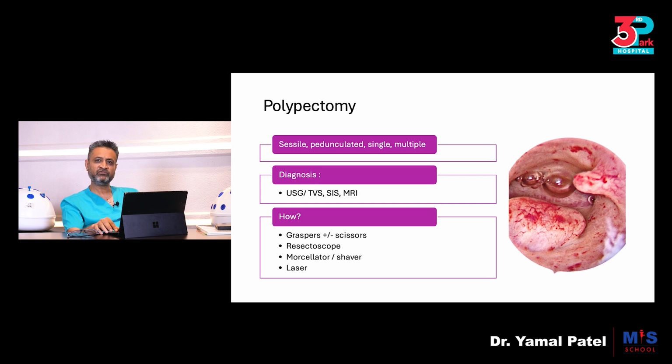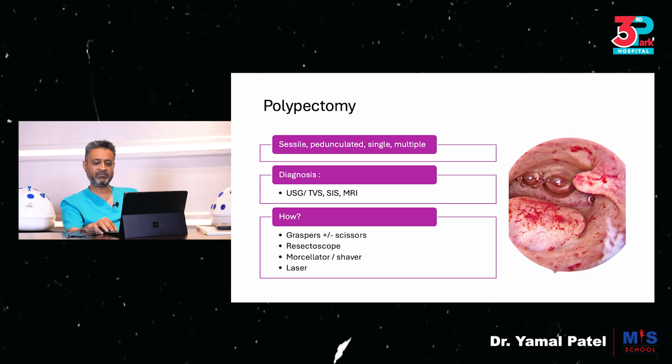Overall, they're diagnosed and confirmed by ultrasound, preferably transvaginal scan, and with a good resolution machine I think it's quite easy to pick this up.